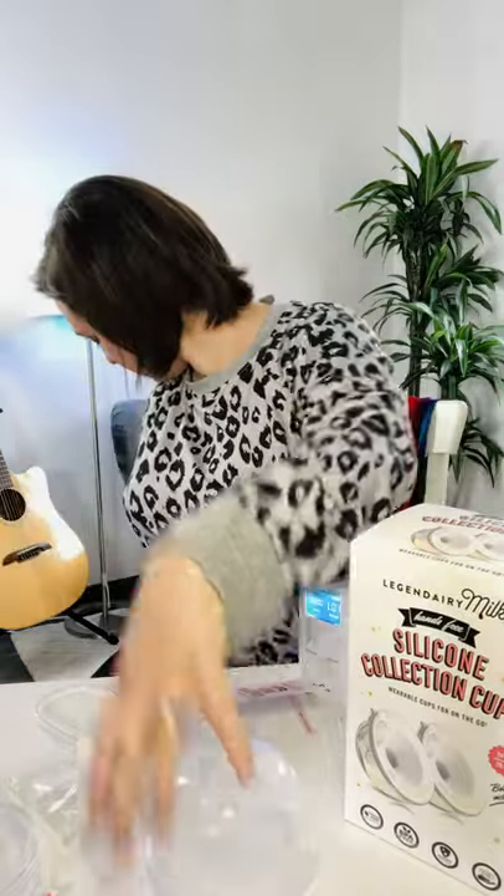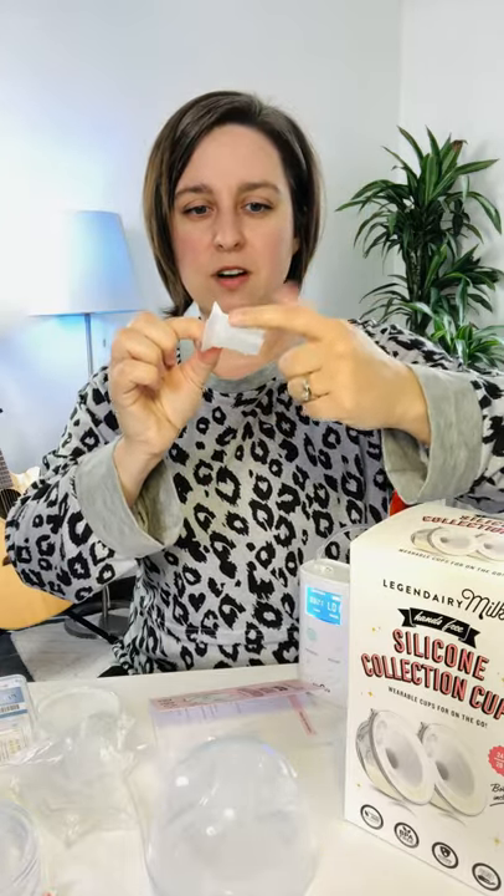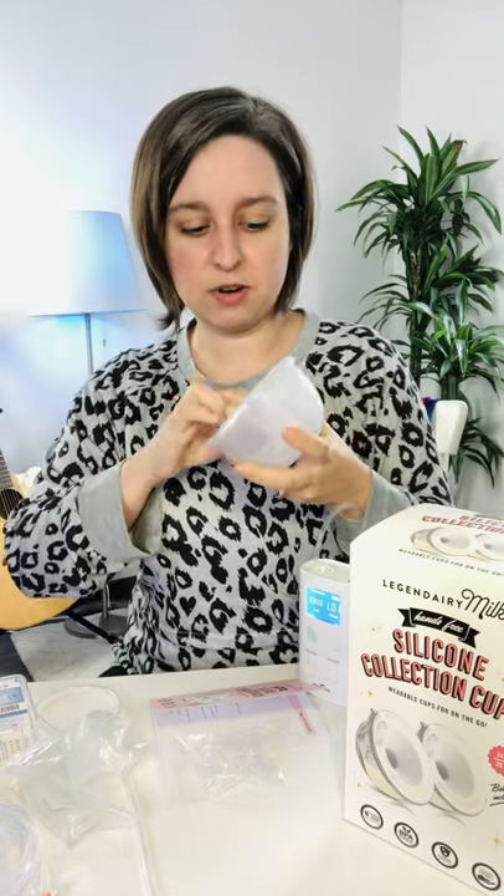They only have two sizes currently, but one of them is a 24 millimeter size, which means it will fit a lot of the common adapters if you need. This one is like the adapters you see a lot — this one's from Maymom, I think. It's a 19 millimeter adapter made for a 24 millimeter flange, meaning the outside is 24mm but the inner diameter is smaller. 19 is actually the size I like to use.